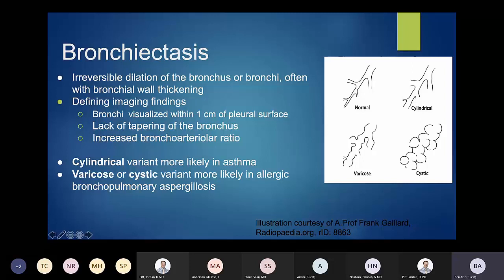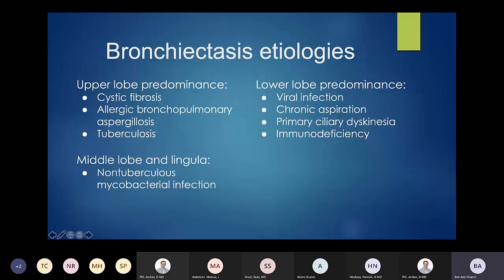Bronchiectasis is differentiated by which lung zone is affected. Upper lobe predominance: mainly cystic fibrosis or ABPA. Middle lobe and lingula: one of our classic indications pointing toward non-tuberculous mycobacterial infection like MAC — if we see bronchiectasis in the middle lobes or lingula, we'll say it's MAC until proven otherwise. Lower lobe predominance: viral infections, chronic aspiration, or less common but board-testable ones like primary ciliary dyskinesia, Kartagener's syndrome, or other immunodeficiencies.